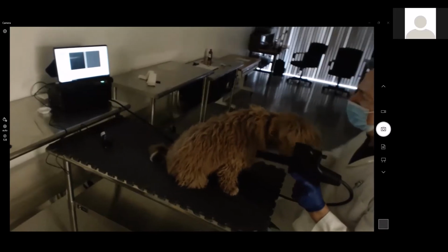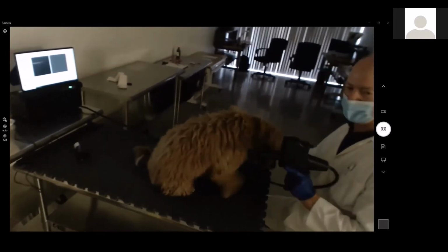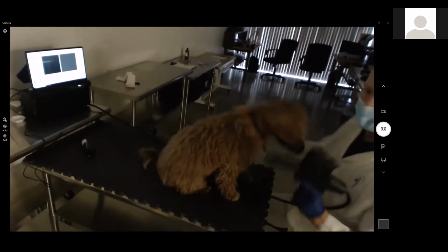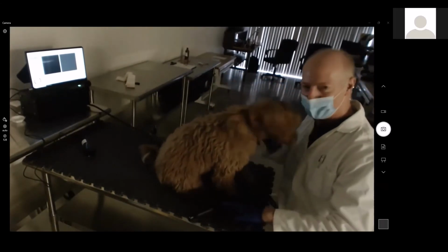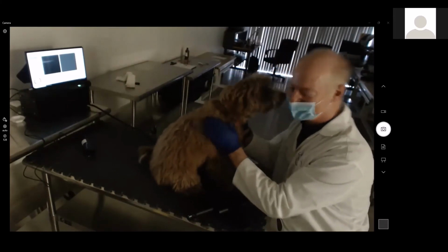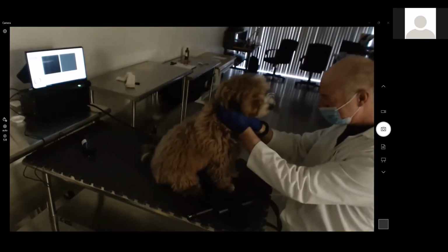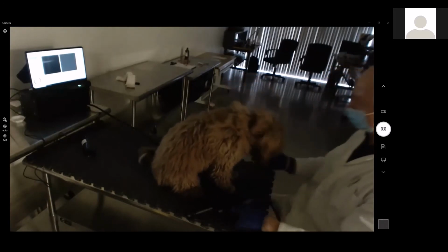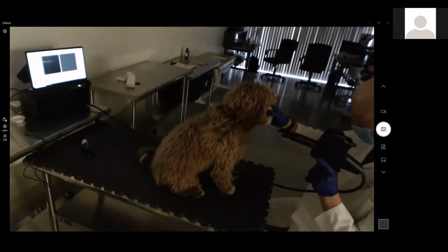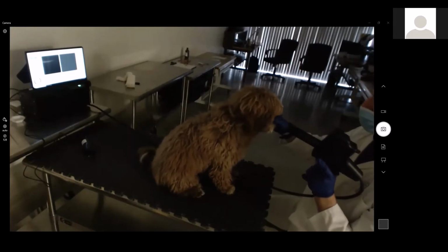Okay, very good. All right, so everyone, you get to observe me attempting to get an OCT on a puppy. This is Axon. He's my buddy. He's my baby. Are you going to work for me? You can earn your kibbles. All right, so we're going to come in here and get the scan going. I have a foot switch over here, by the way.